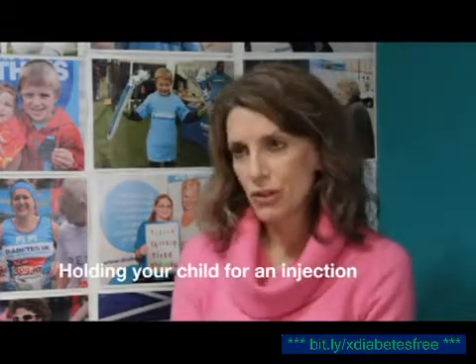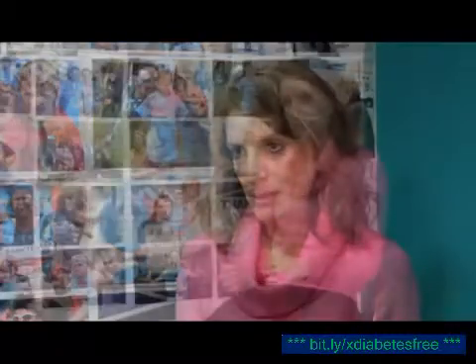When you're giving a baby or a toddler an injection, you need to hold them quite securely, but not too firmly. Think about which site you're going to use. If it's going to be their buttocks, you might like to lie them over your lap and inject in the buttocks. If you're going to inject in their legs, you might like them to sit on your knee so that they can cuddle you and you can reach round them and do the injection. Parents do find ways that work for them, and your children's diabetes team can be really useful in showing you ways of holding your child which is secure but not too firm.